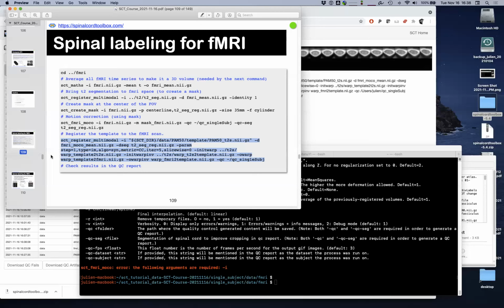Yeah, I actually would not smooth because it's very small in the in-plane direction, and I don't think it's a good idea to smooth across the slices because they are too thick. That's what I mean when I think of the problem. That's what I believe. But I'm thinking that usually in the brain you have to smooth in order to make the noise more amenable for the GLM.